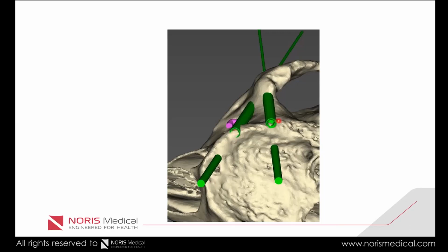And then we take the posterior implant and position it the best we can based on the anterior implant. The other way around, if we start with the posterior implant, not checking that, we might be wasting bone, and later on it will be very difficult to position an anterior implant correctly, or maybe not at all.